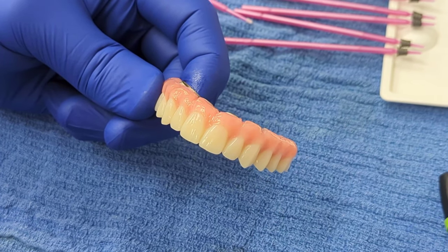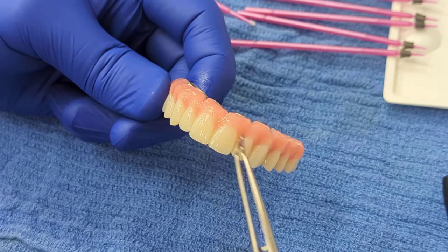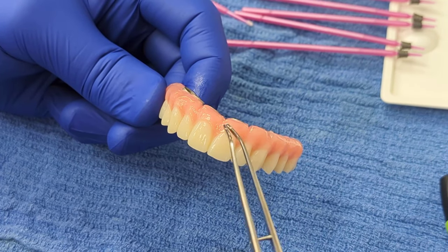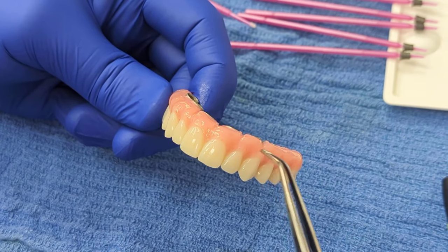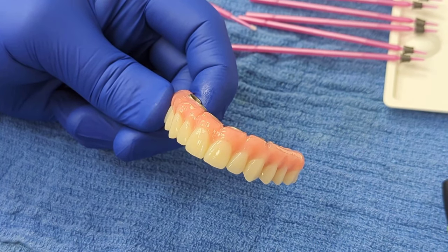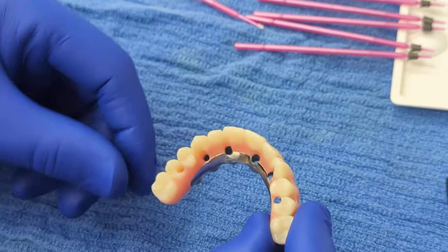When they're put against an acrylic, there isn't a chemical bond, and over time what you'll see is a micro leakage around the necks of these. And so we don't use a gingival mask of composite, we use a gingival mask of acrylic because it's like material. And let's talk about the substructure for a minute.